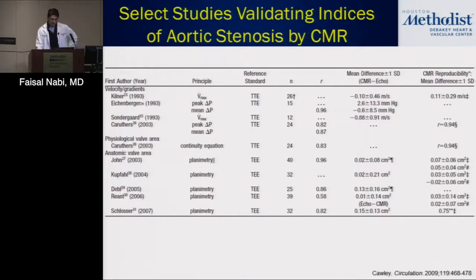Now, if you look at some studies that have been done validating these measurements by CMR, you can see it's been compared to both transthoracic echocardiogram and TEE, and I won't bore you with that. The correlation was very good. I think all of y'all have had some experience now in your own use, and hopefully you've seen value in it.